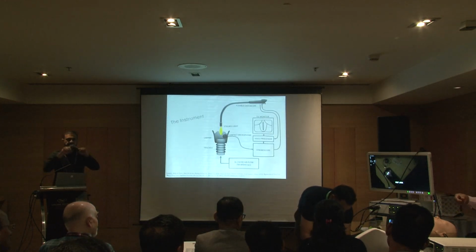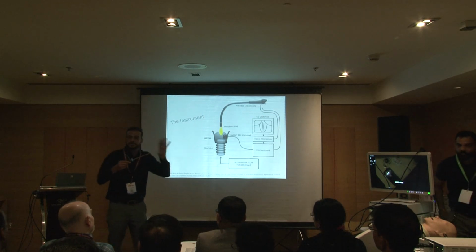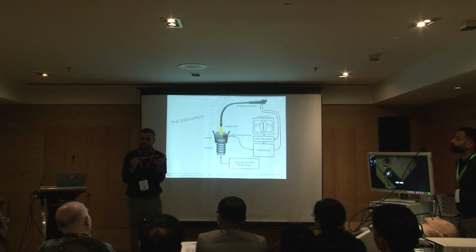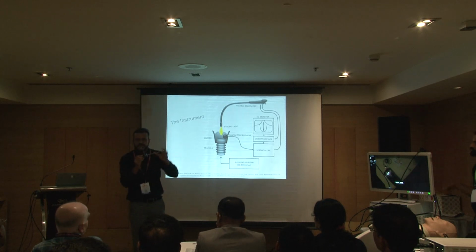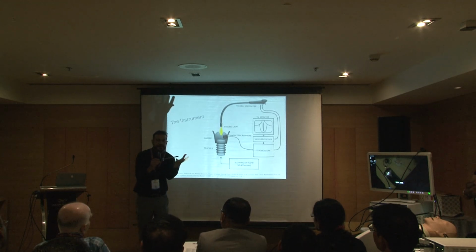Now when we use a 10 mm scope, this will give us a wider picture. We want a wider picture. We have seen the vocal cords, but we need to see a wider picture of the patient's vocal cords, and so a rigid stroboscope is very, very important. I tell all my students and juniors that even if you have a flexible scope with strobe, always use a rigid scope, because it gives you a magnified view.